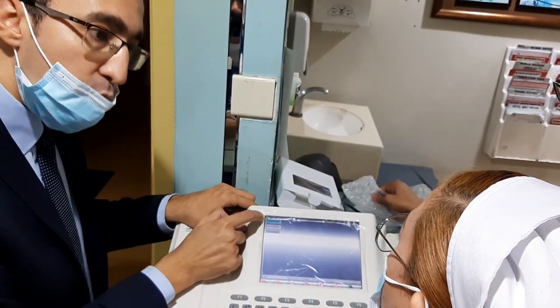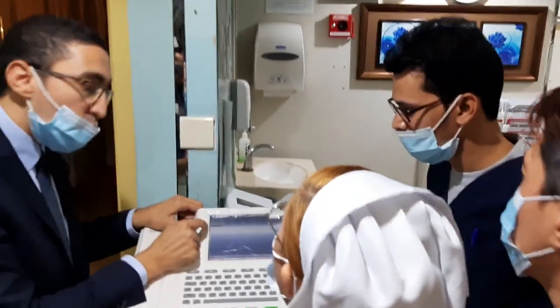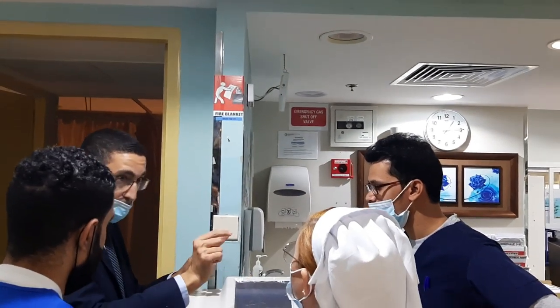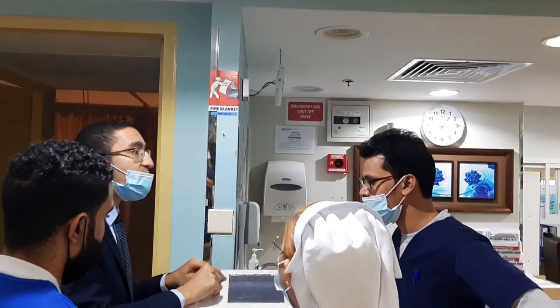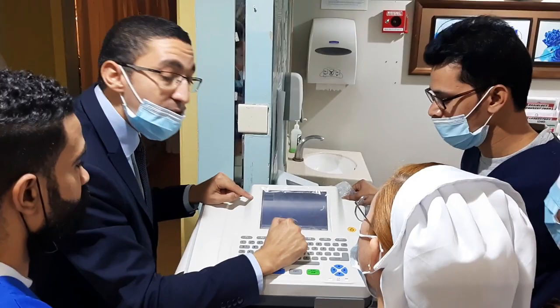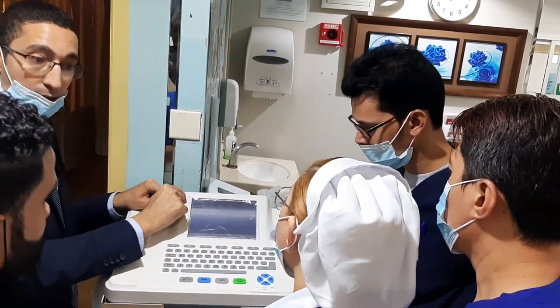10 November 2021. Here 10 November 2021. 10 November 2020. Patient number 0, patient number 1, patient number 2. You should know about the time. If you know the date, you can search by date. Also if you highlight, the name will appear here, like Isa. It's appearing the name, just by highlighting.